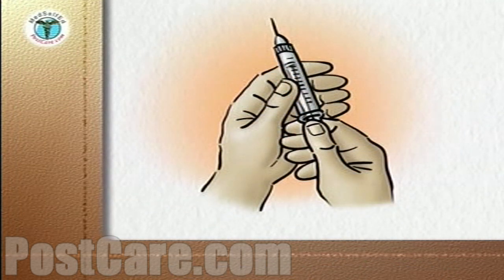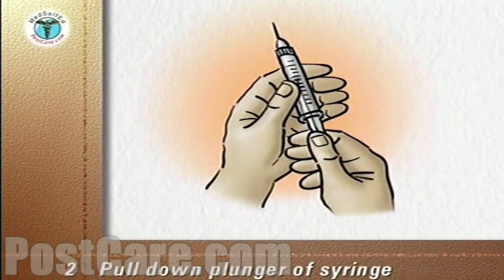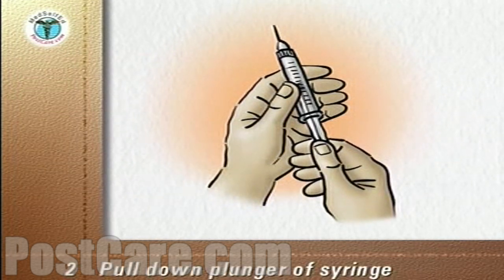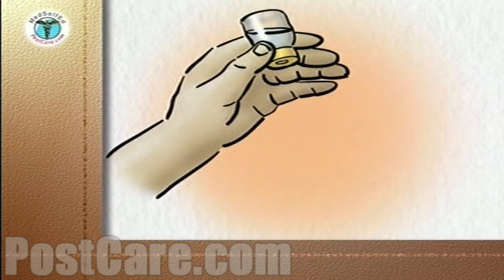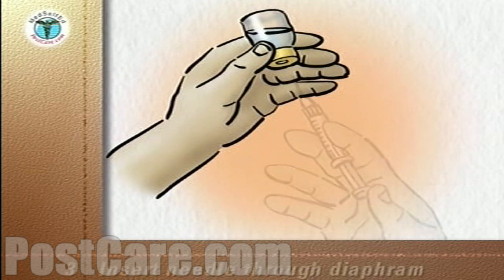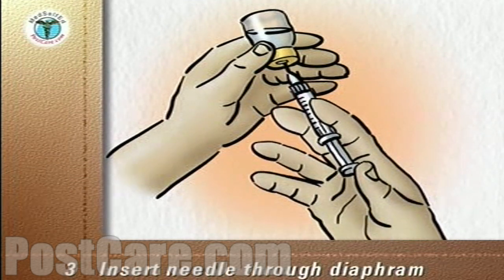Remove the cap from the needle. Pull down the plunger of the syringe until it contains the same volume of air as the medication you are going to give. Hold the vial upside down at eye level. Without touching the needle, insert it through the diaphragm of the vial.